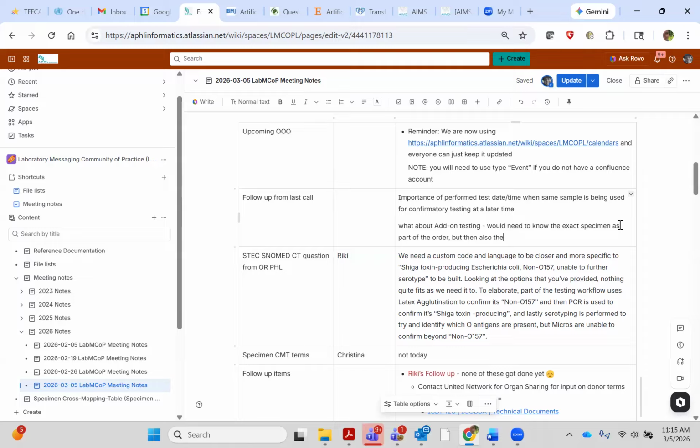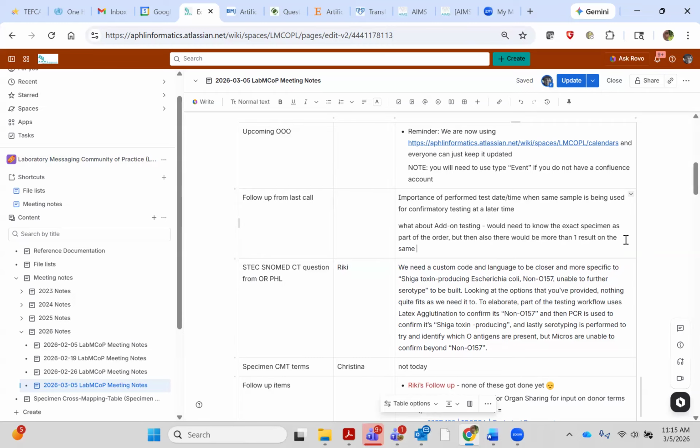So then you said something about needing to know what the lab results were for the confirmatory test. Well, you're not going to do a confirmatory on all specimens. Because if you have a negative drugs of abuse screen, it wouldn't make sense to do a confirmatory, unless it was a false negative. I'm trying to figure out how we make this a use case, and I'm obviously not understanding how it's a use case, which is my own fault because I should have attended the meeting.